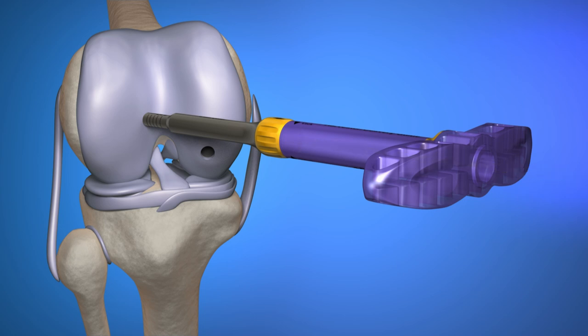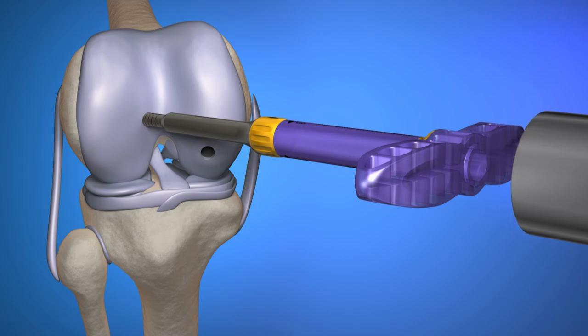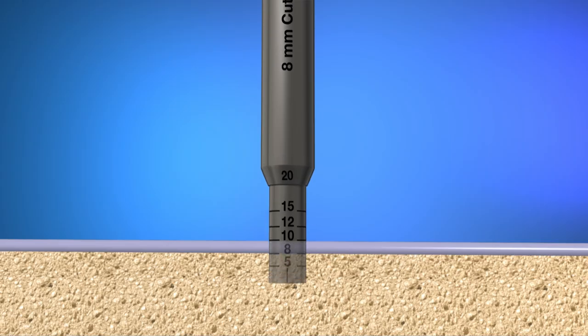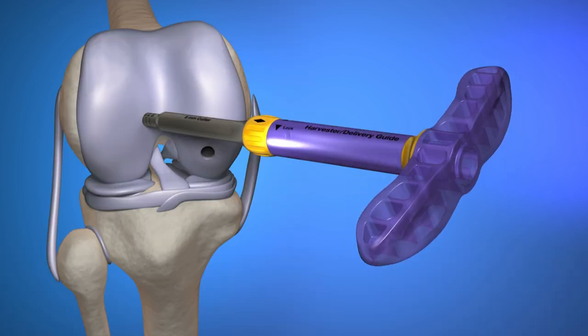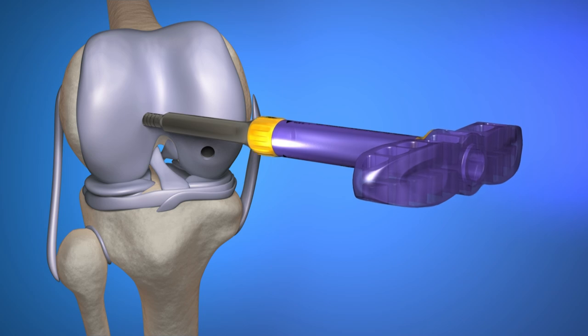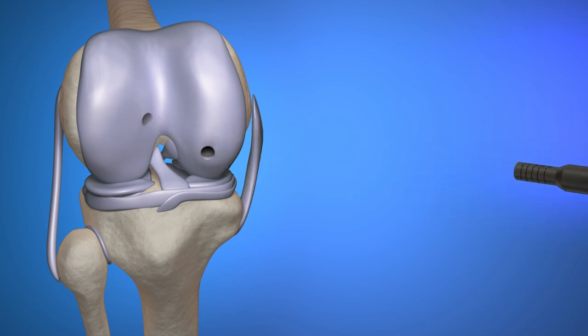While maintaining perpendicularity, use a mallet to tap the guide cutter to the desired depth mark. Make note of depth for later use with backfill plug. Rotate the T-handle two complete revolutions, then withdraw the assembly while gently twisting the T-handle.